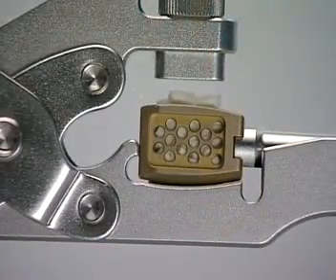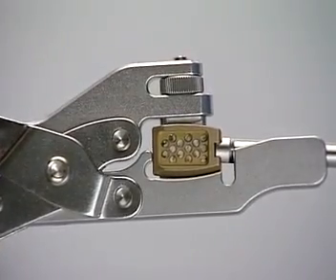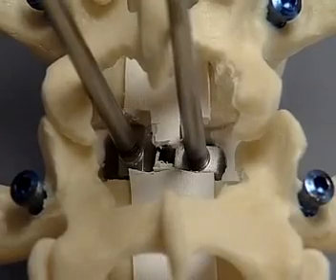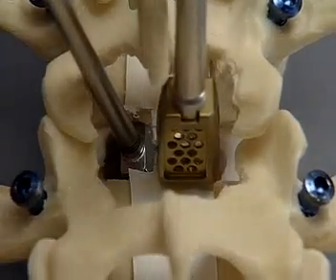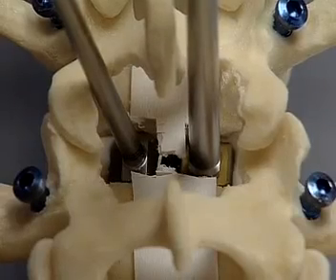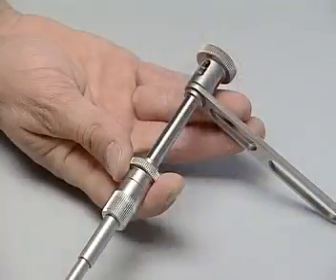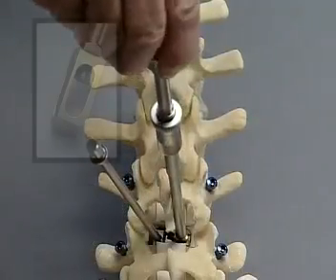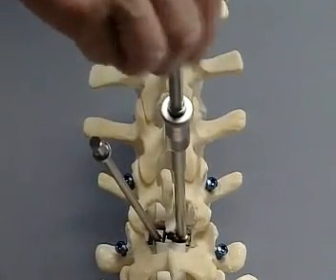The cage functions as a spacer containing bone graft in order to achieve a bony fusion between the two vertebrae after healing. After removing the smaller spreader, the cage is inserted so that it is at least three to four millimeters below the posterior portion of the vertebral body. This cage is designed to be rotated 90 degrees — it must go clockwise; if not, it's difficult to turn the implant. If it's necessary to compact the graft, the sleeve is pulled back and the screw is tightened. The sleeve is then loosened and the implant holder removed.